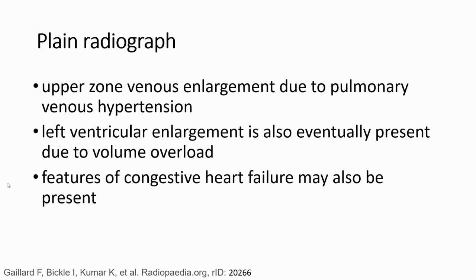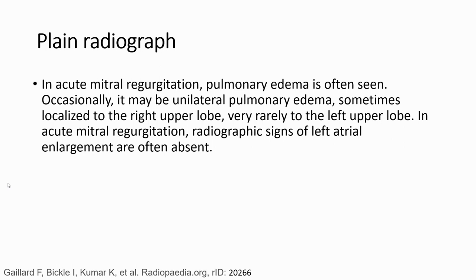We can find upper zone veins enlarged due to pulmonary venous hypertension. Left ventricle enlargement is also eventually present due to volume load. Features of congestive heart failure may also be present.